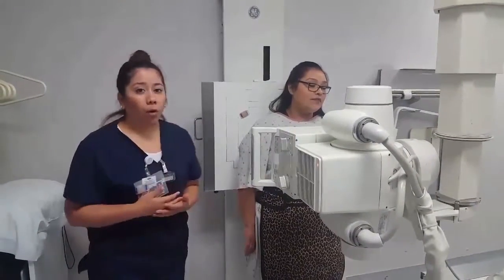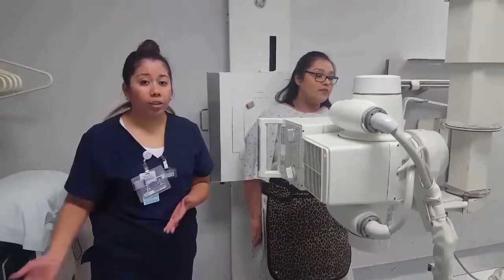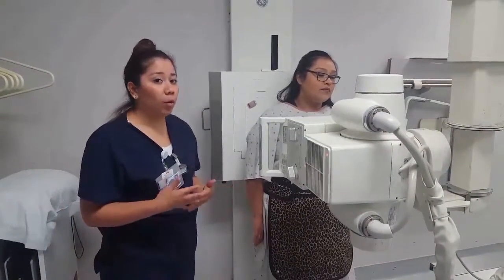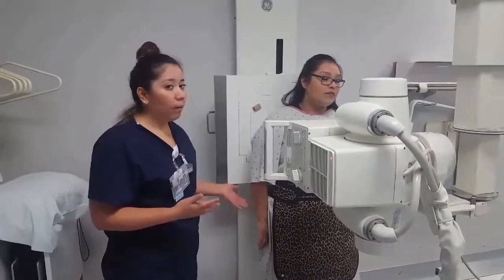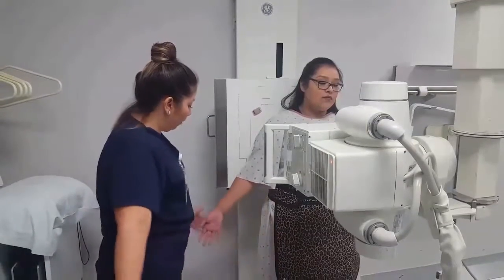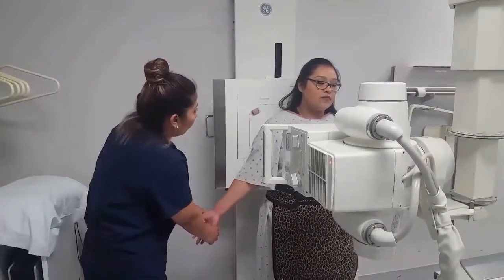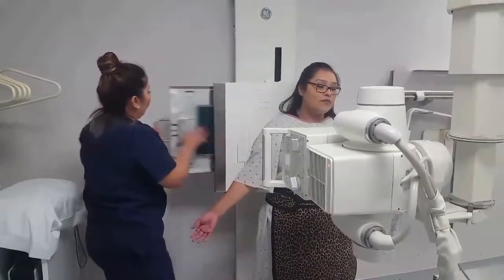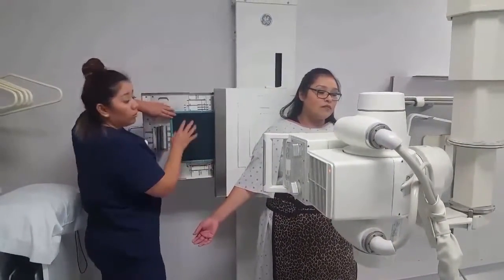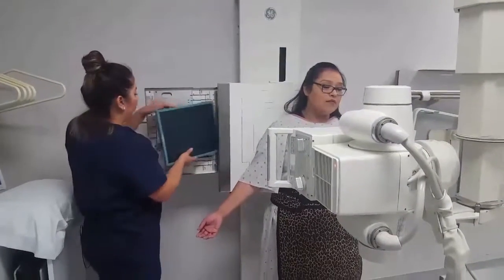So next I'm moving forward with my AP shoulder with external rotation. The only change I'm going to be making here is having my patient extend their arm out. So you can go ahead and open it up, and the hand is going to be supinated. That's fine there. Another thing, remember to remove your IR. I've gotten a new IR, I'm placing it back in.